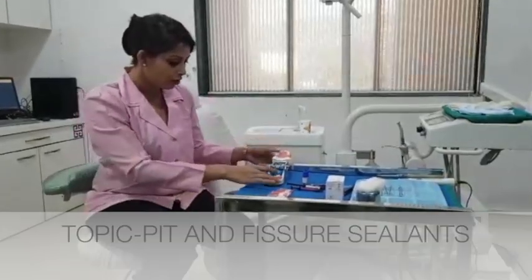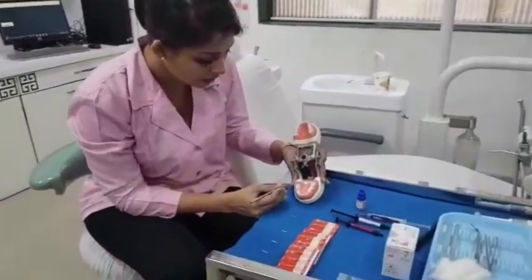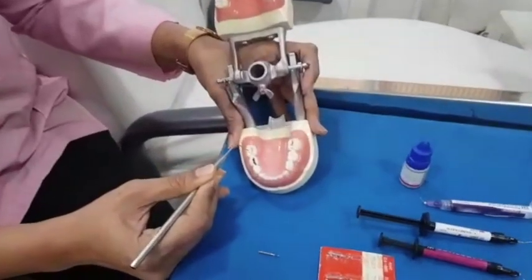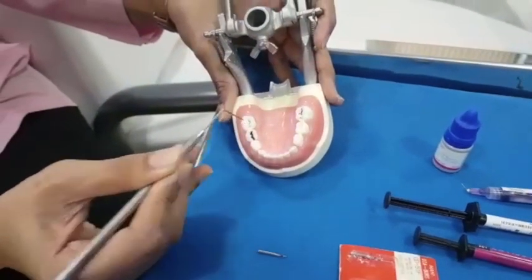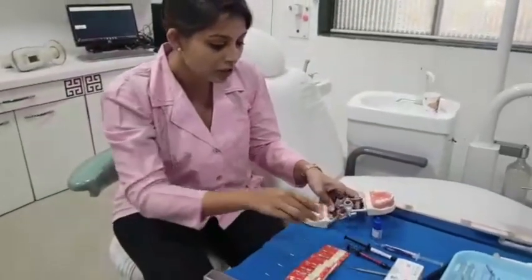So we have a typhodont here and I am going to show you some grooves that we have created with the marker. These are blackish pits and grooves — you can assume that they are stained, that is why they are a bit black. Do not expect them to be cavitated, because if you have a cavitated lesion, it is not pit and fissure sealant that you would be attempting; you would be going for something like a preventive resin restoration. In this case we are sealing the stained pits and fissures.